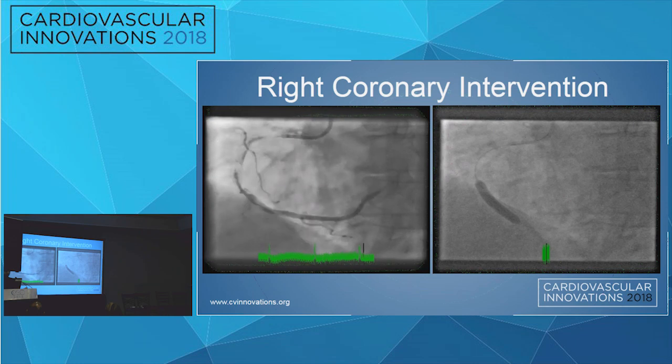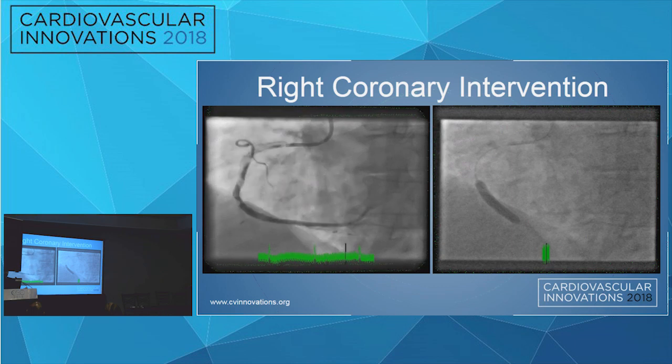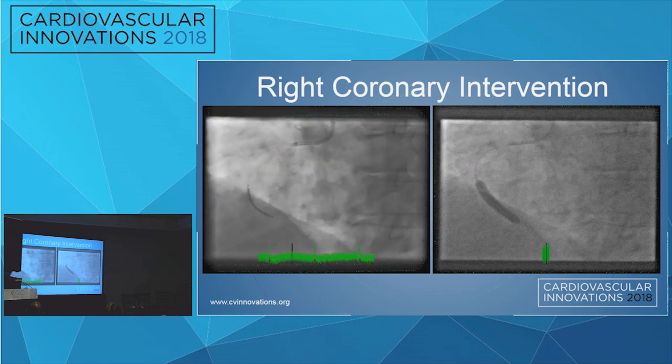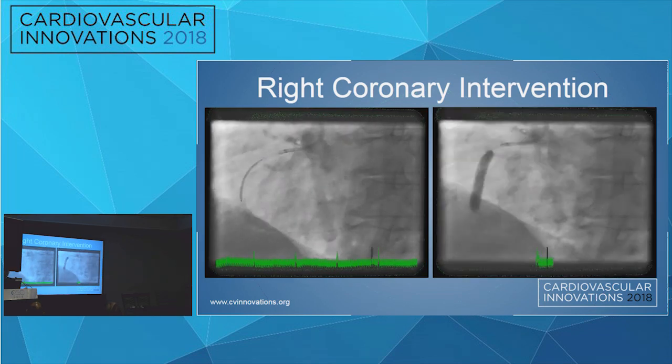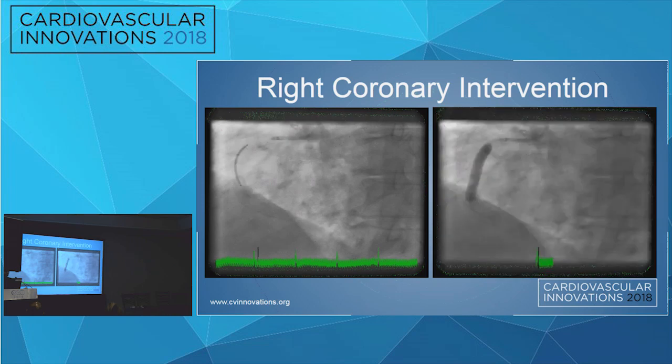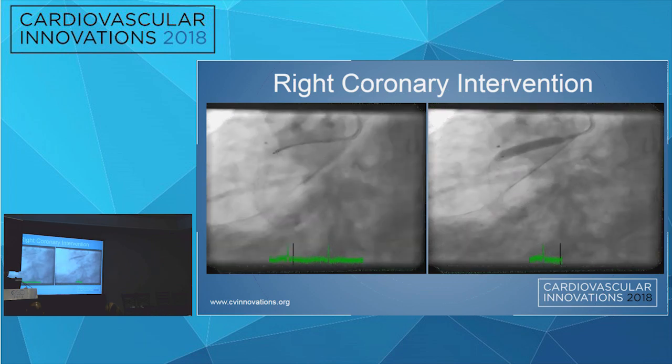So I began stenting really distal to proximal, not so much the very distal lesion, but I wanted to take care of the main RCA first and get some stents there and open up that portion of the vessel, and then maybe get a better look at what was going on in the posterolateral branch. So I stented with Resolute Onyx 5.0 stents, stented the distal, then the proximal, overlapped by about a cell or two along the way, stented the proximal right as well. I was sure to cover the ostium all the way out.